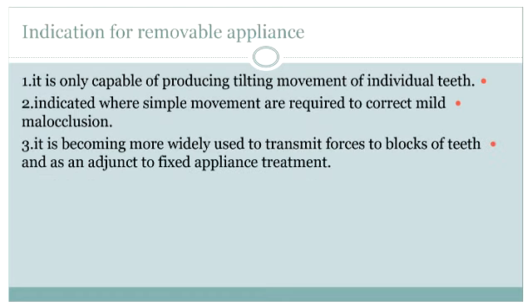Indications for removable appliance, we put simple points about that. It is only capable of producing tilting movement of individual teeth. Indicated where simple movements are required to correct mild malocclusion.